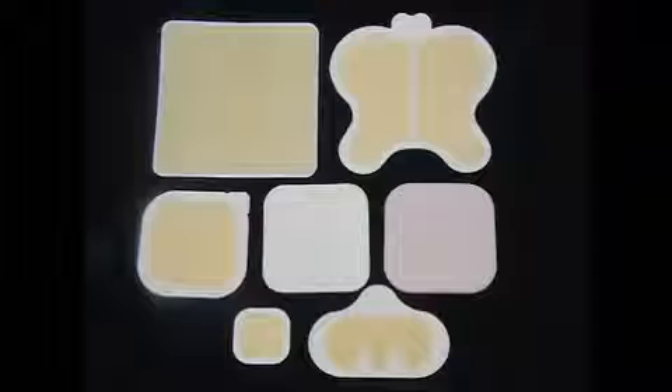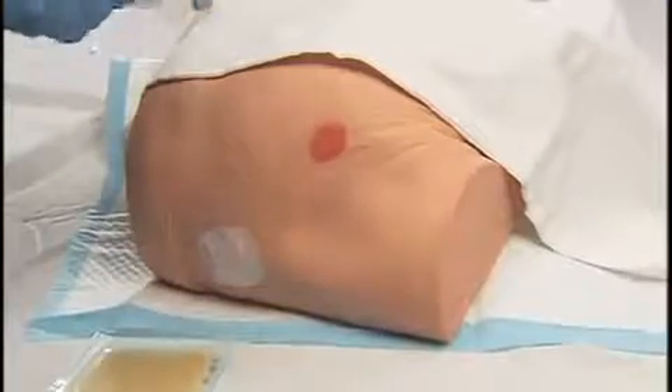Hydrocolloid is an occlusive wafer dressing containing gel-forming agents with a flexible, water-resistant outer layer used to promote a moist wound environment. It supports autolytic debridement, provides insulation, and protects the wound — nothing in, nothing out. It is available in various thicknesses and in pre-cut shapes for body areas such as the sacrum, elbows, and heels. It is changed every three to seven days depending upon the manufacturer.